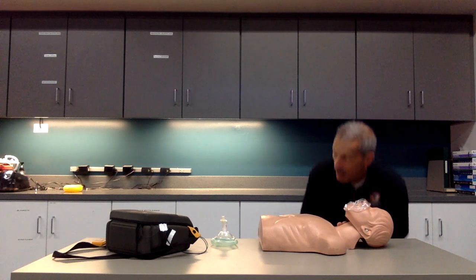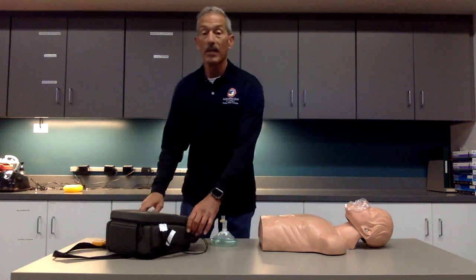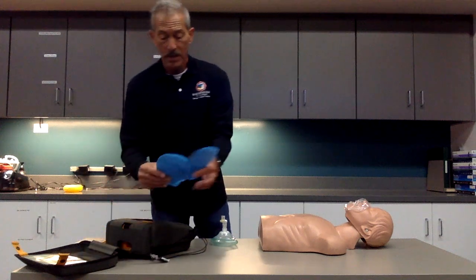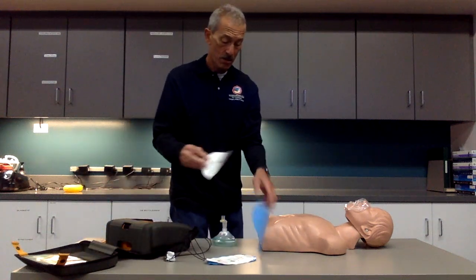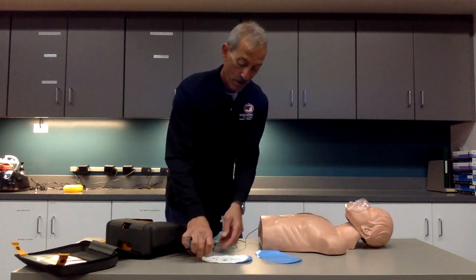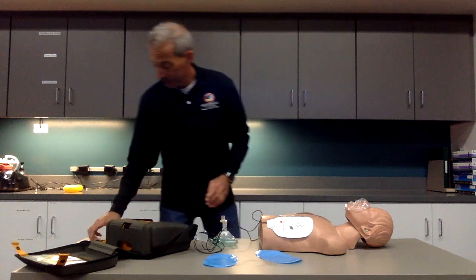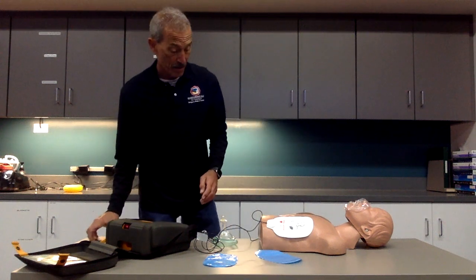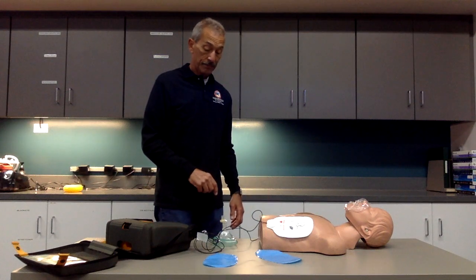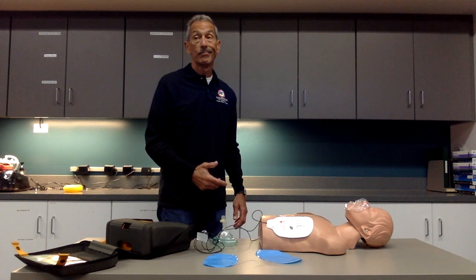The patient is still pulseless and apneic. Now my partner is going to take over compressions and ventilations while I turn on the AED. Turn on the device, attach the pads, connect electrodes. Push analyze — staying clear. I'm going to analyze now. Stand clear. Analyzing now. Stand clear.